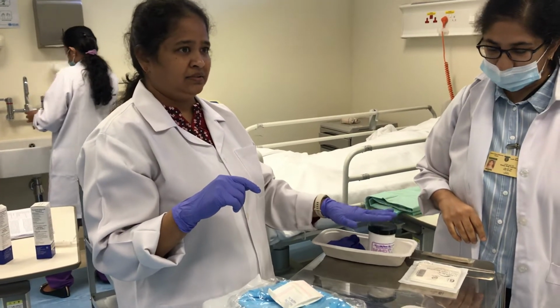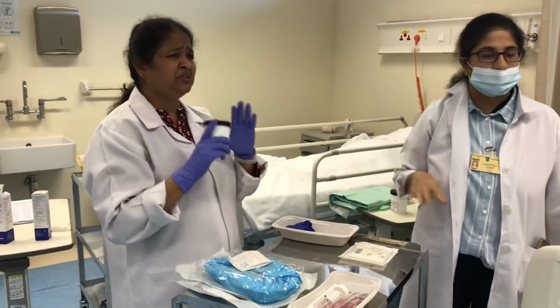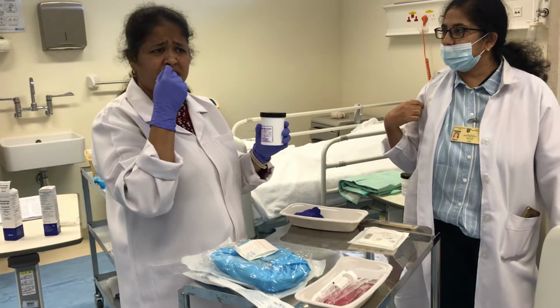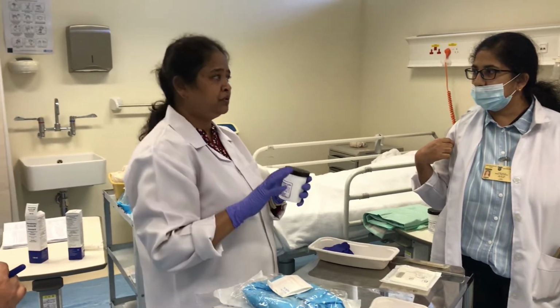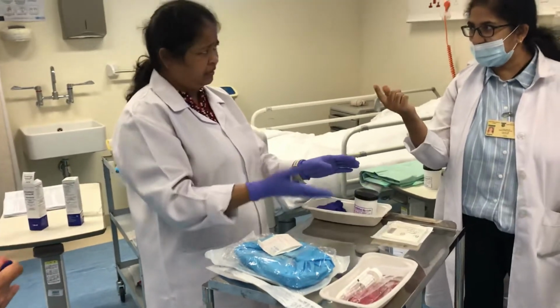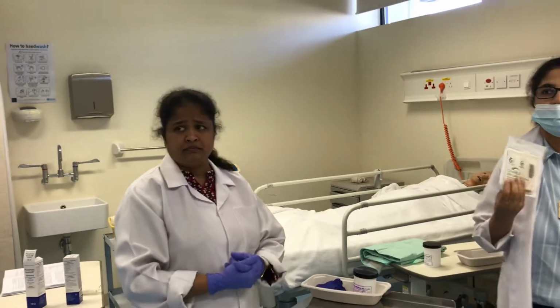Please, this is only because of the urinary procedure for the medical. Even for vaginal, because it's sterile, we cannot use this. For other procedures, rectal, NG tube and all, it's not a sterile procedure. I will try to get it before we show it to the students. The students should not have the wrong idea. Many years back we had Xylocaine jelly.